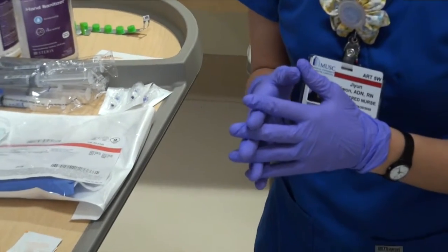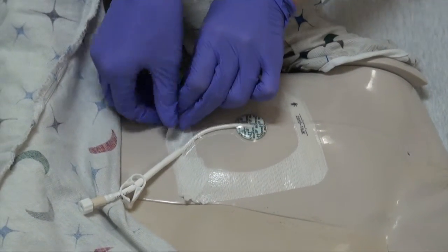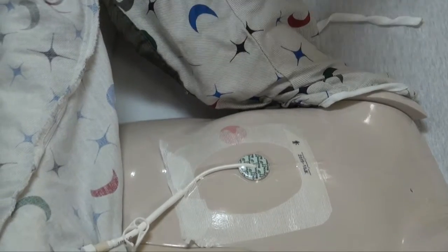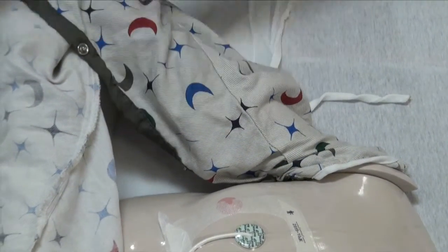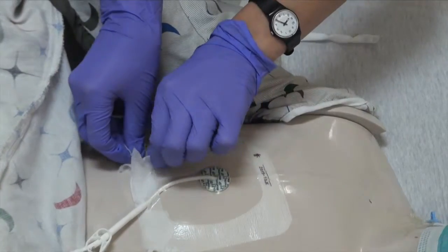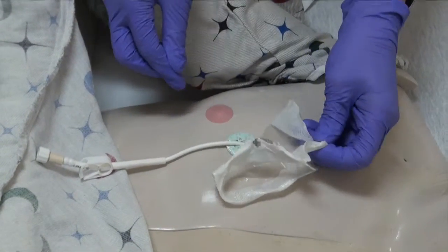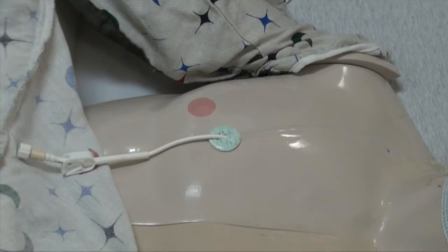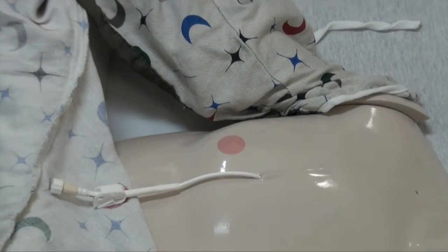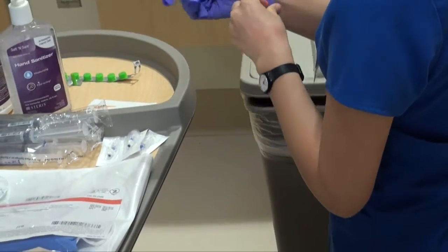We are now going to remove the dressing on the central line by pulling away from the hub towards the insertion site. If you have difficulty, you can use alcohol wipes. Once the dressing is removed, you want to remove your gloves and wash your hands with hand sanitizer that is at the sterile field near you.